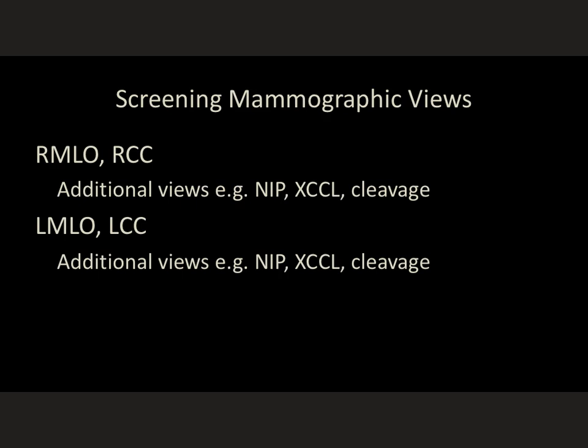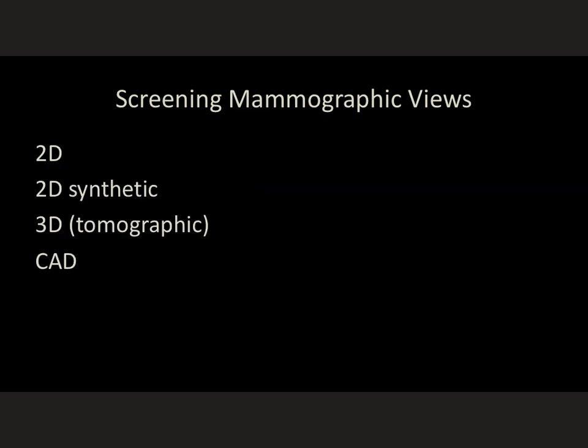A standard screening mammogram includes right MLO and right CC views, left MLO and left CC views. And then there may be additional views of either breast, such as nipple in profile, extended CCL views, or cleavage views in order to obtain the entire breast. Screening mammograms include some combination of 2D images and 3D tomographic images, which are now widely available at most institutions. The 2D images may be digitally acquired or they may be synthetic, or you may have both — and I'm going to show you a workflow system that has both.